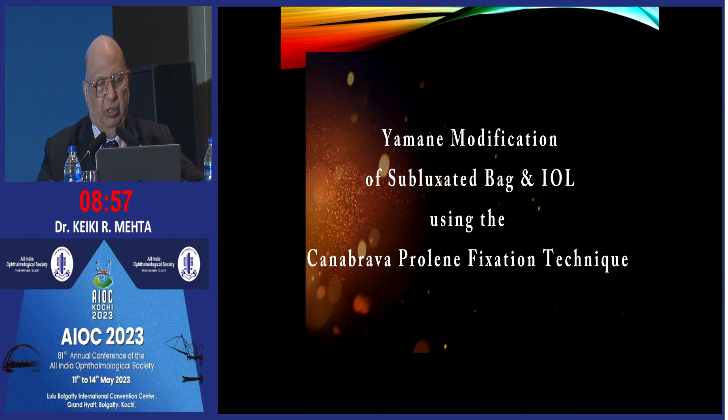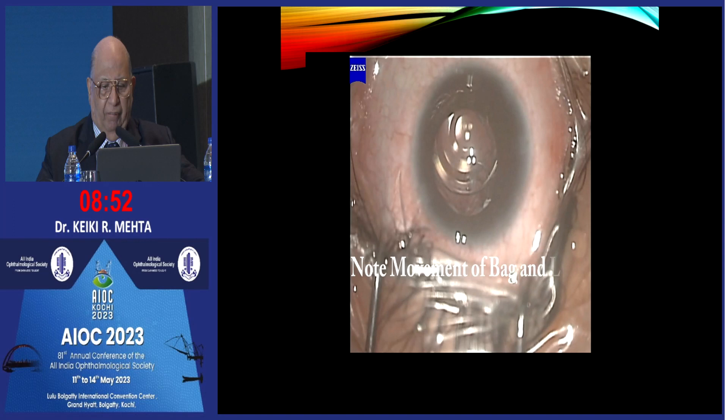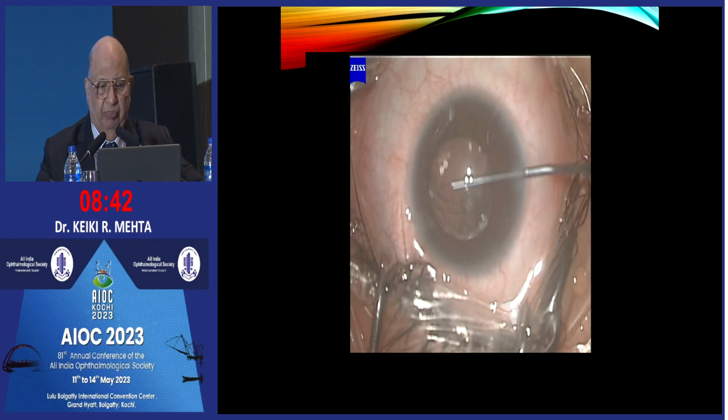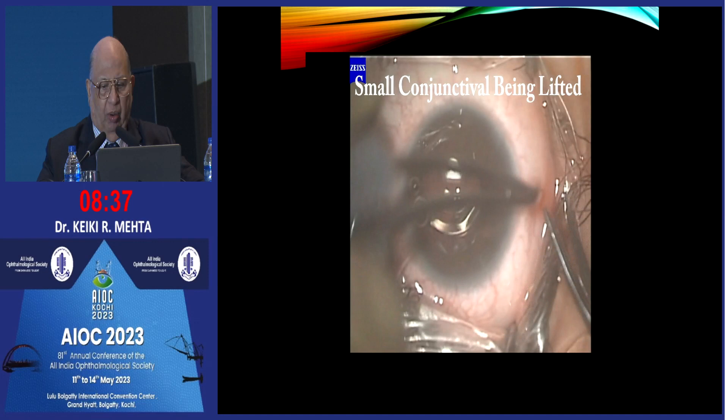Yamane was the one who made the original entry points — that is why I am going to show it to you. First, let me show you the bag and the lens. This is as it was. If you notice, the lens bag — everything is moving.